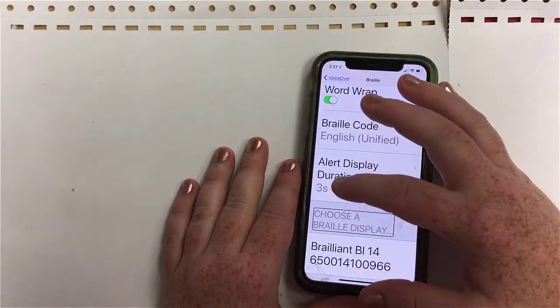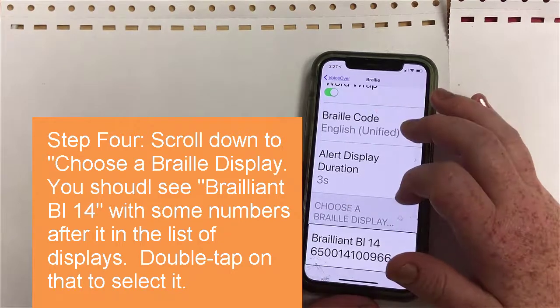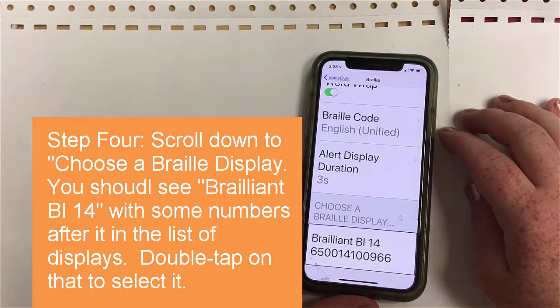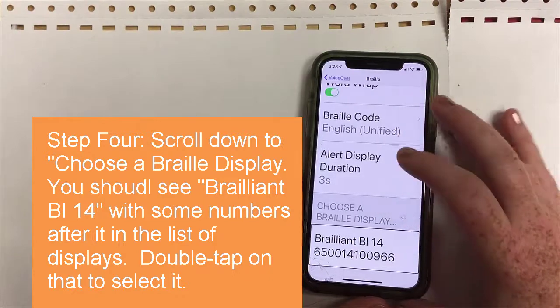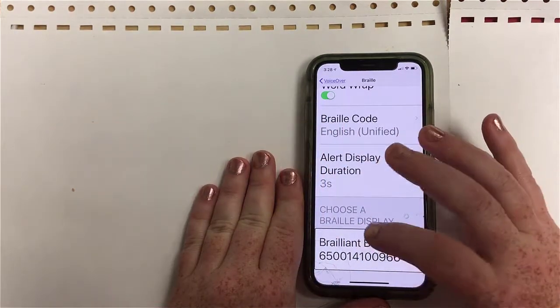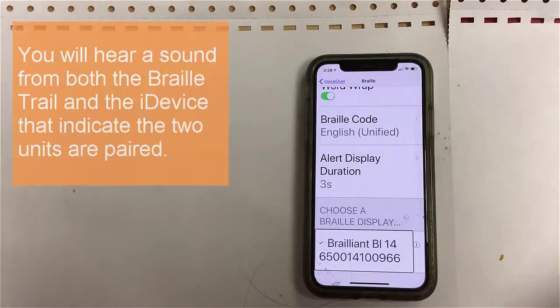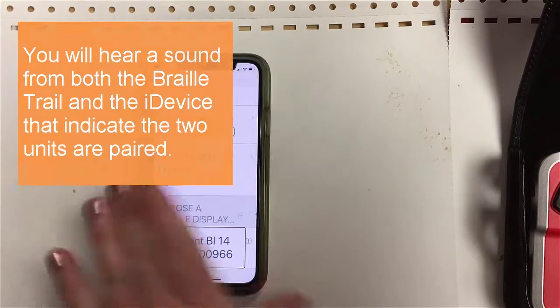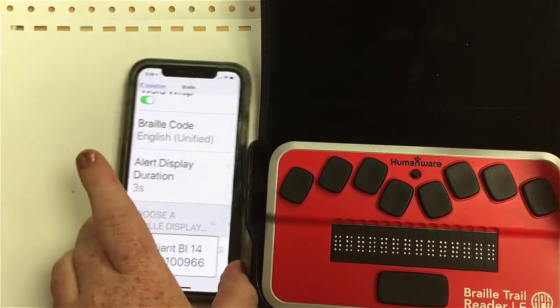What I need to do now is choose a Braille display. Because my device is already in terminal mode, I'm going to select it — I know it's the right one because it's the only Braille display I have in proximity and it's the only one that's turned on. I'll go ahead and open that Braille display option and it will allow me to pair it. If you heard that little beep, that selected my Braille display.